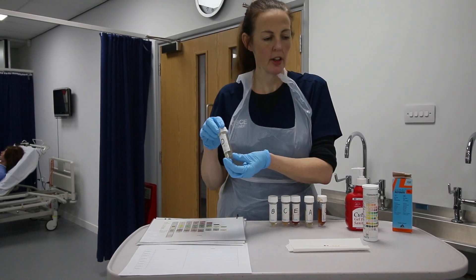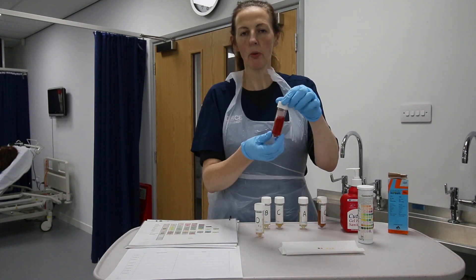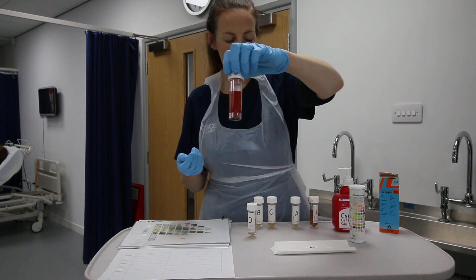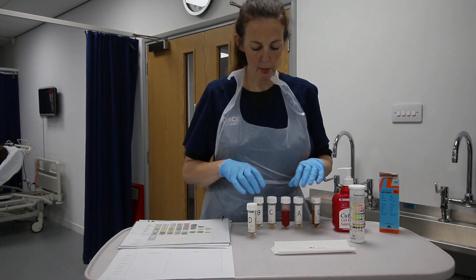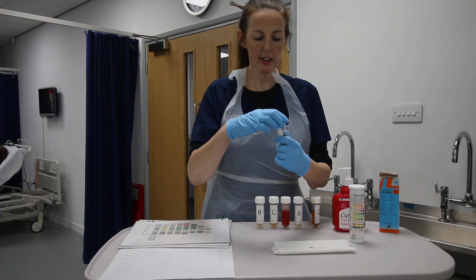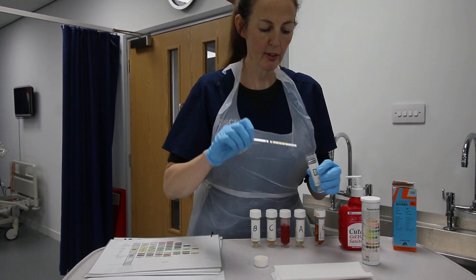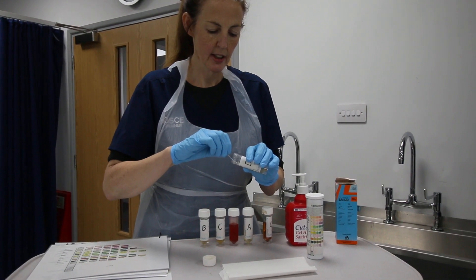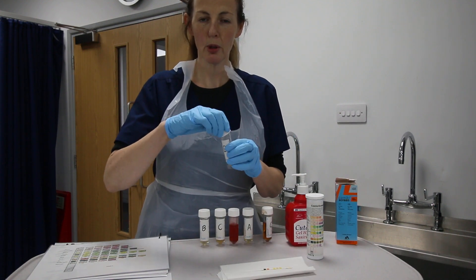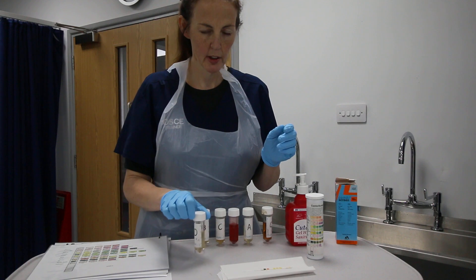The first thing we do when assessing urine is look visually and note any abnormalities. This sample is a tiny bit cloudy. For the hematuria sample, if you look at that one it's bloody in colour — obvious hematuria — which you'd note in your visual description for your OSCE. I'm now taking the sample, being careful to avoid splashes, submerging my strip fully into the urine, then placing it on my absorbent tissue and leaving it for two minutes as per manufacturer's instructions.